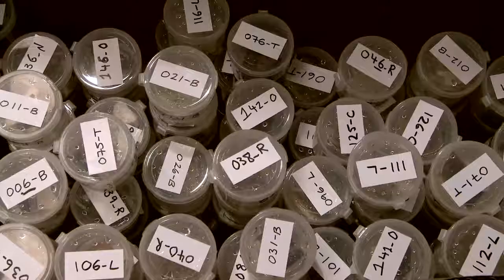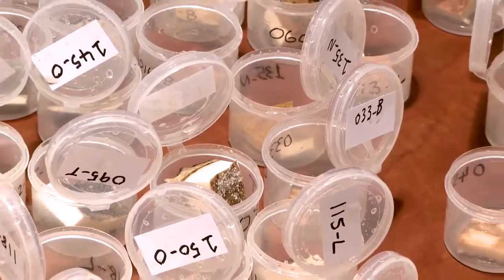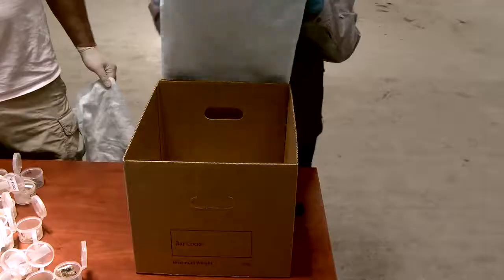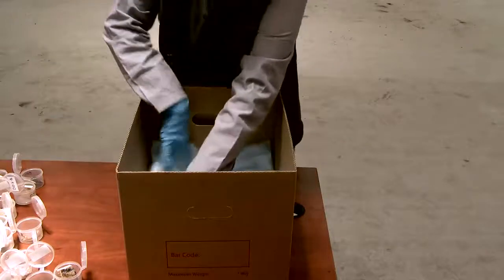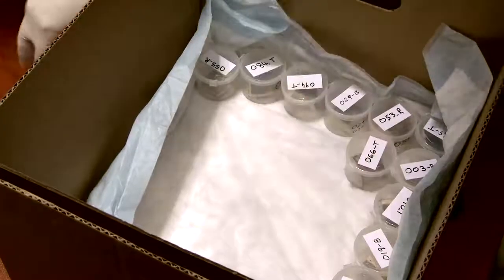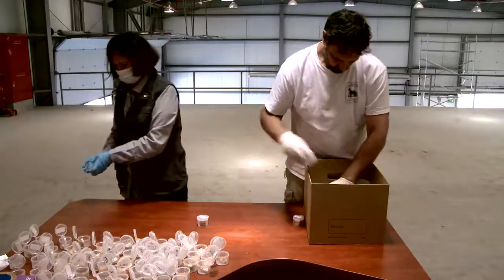The following measures will help ensure that samples do not get damaged, delayed, lost, or refused entry to the analysing country. Line each box with a plastic bag. Place an absorbent liner inside the bag. Newspaper or other paper products can be used. Place all samples inside the bag, ensuring that all containers are tightly closed.